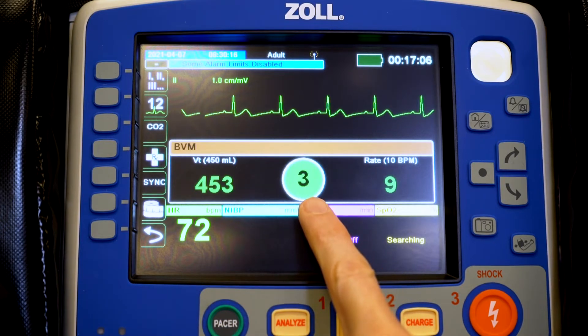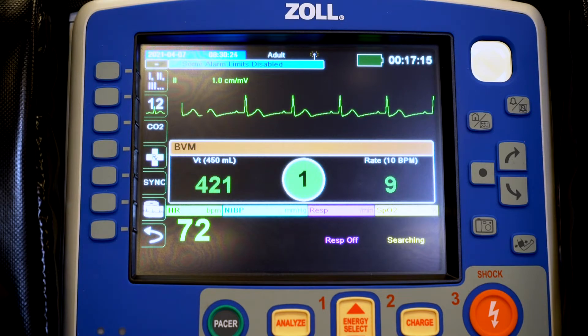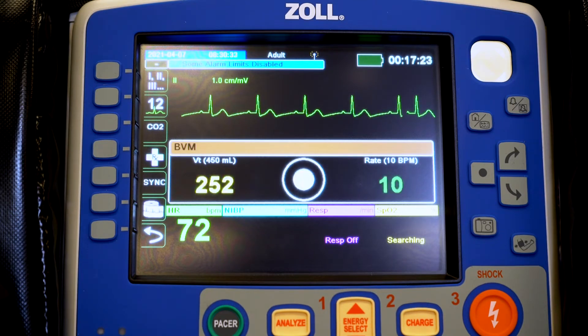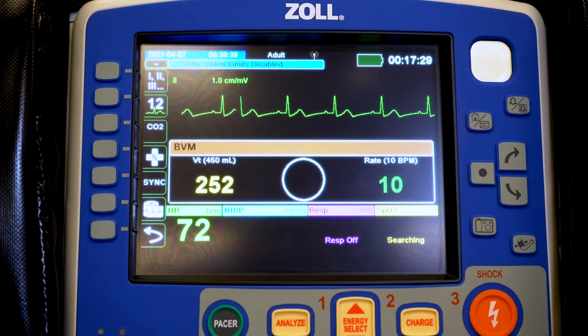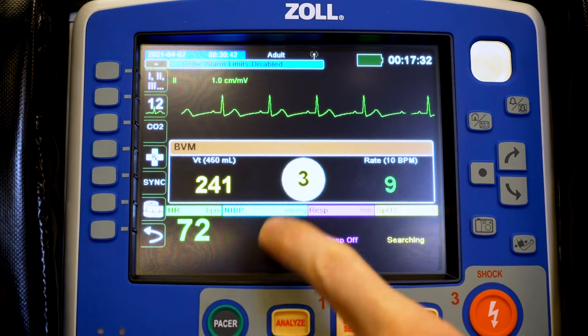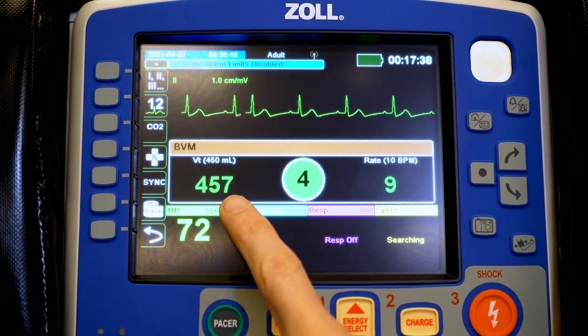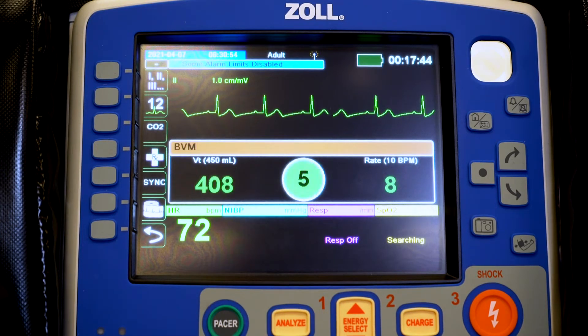The center section is our volume perfusion circle. As it fills up, it lets us know that we've reached the set volume of 450. If we don't reach it, you'll see it turn yellow and only partially fill. On the far right we have our rate, preset to 10 breaths per minute — once every six seconds — which is also our countdown timer. When we're out of parameters we are yellow, and when we're within parameters, plus or minus 50 on our volume, we are green. Much like CPR feedback, we want to be green across the board.